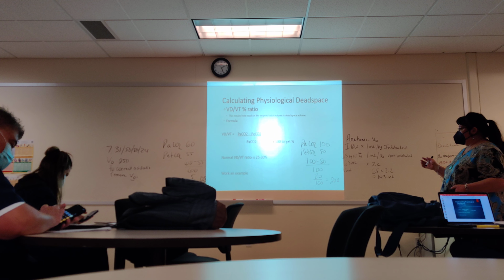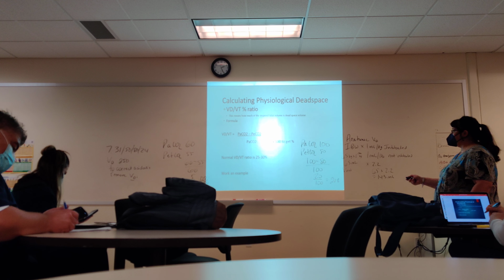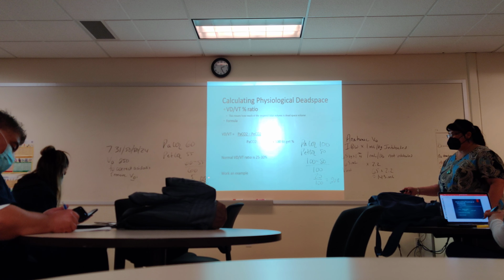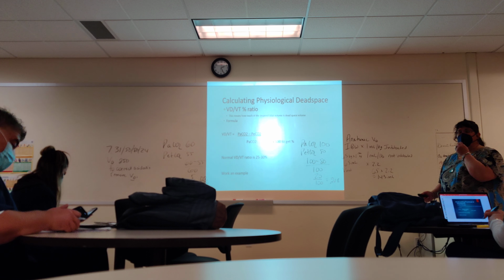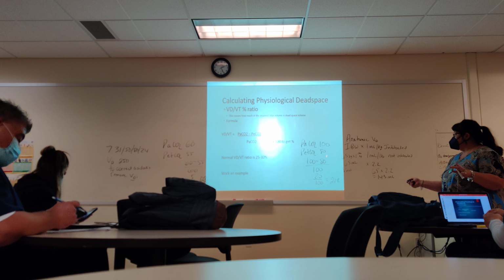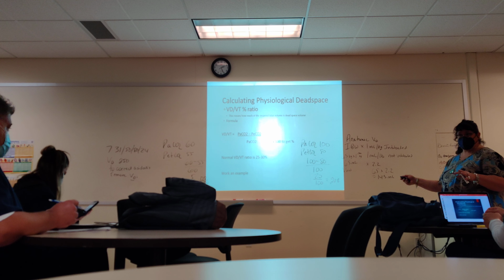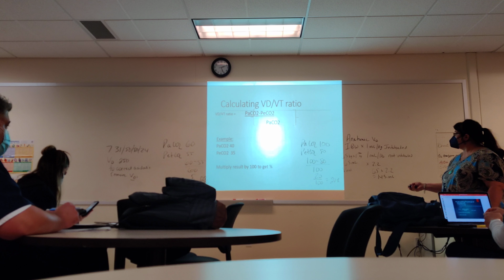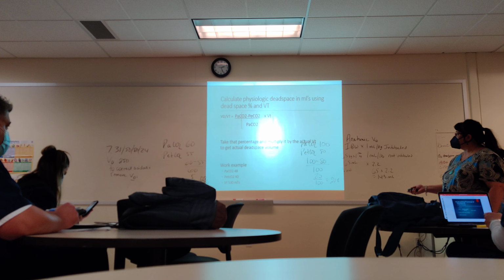Find the percentage, or I actually could take that beginning portion where I had my 0.08, and I can figure out what the actual loss or the actual dead space volume is. Okay, so first of all, are we clear on how to do this part right here? Okay, I'm going to move on.